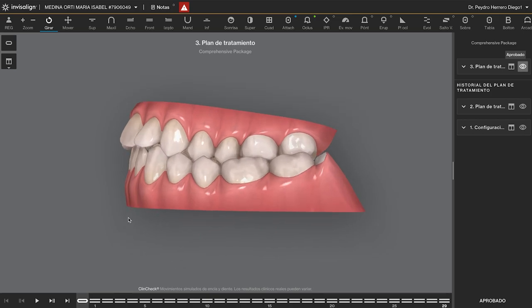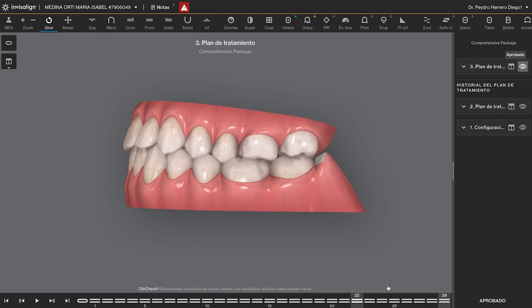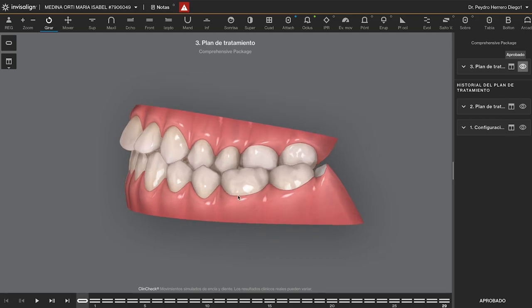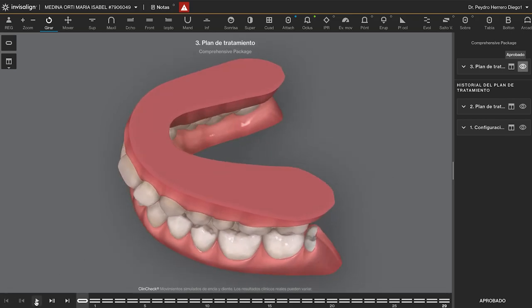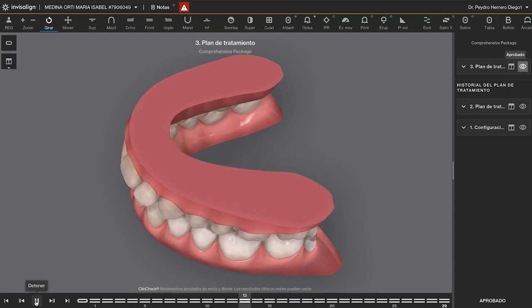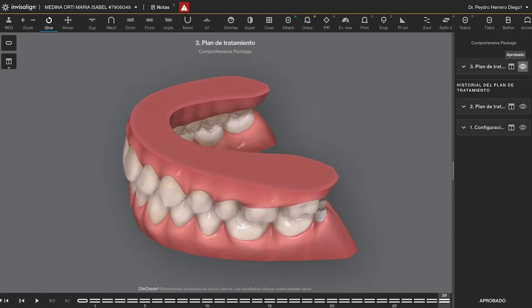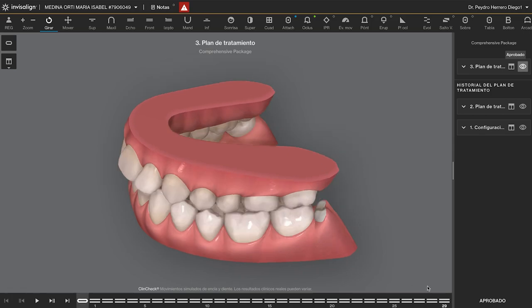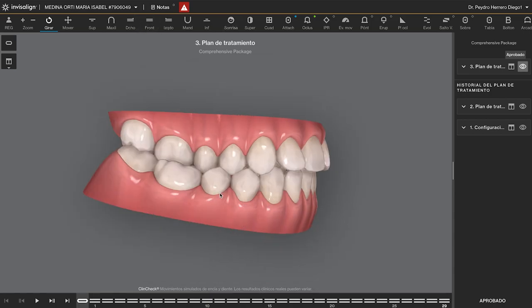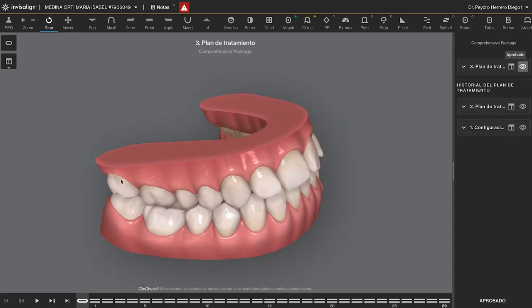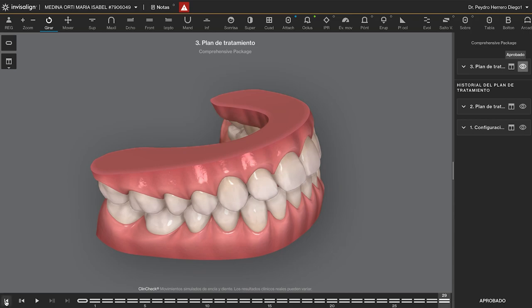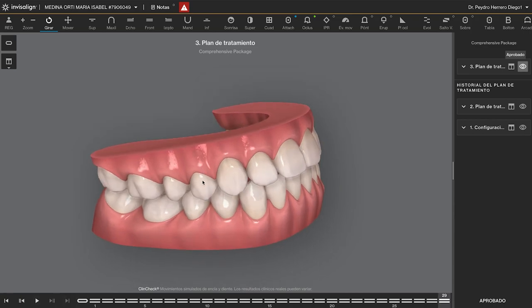If you want to reduce the torque of the upper incisors, it is mandatory to create space in the back. What I'm telling them is to expand the arch and use the space of the expansion to reduce the torque. Look at this huge expansion. To expand on the right side is easier because the second molar is not in crossbite, so I can use the second molar as anchorage to expand.